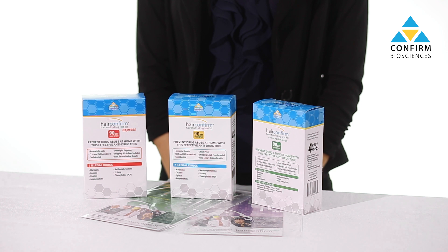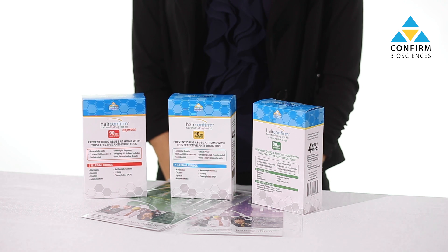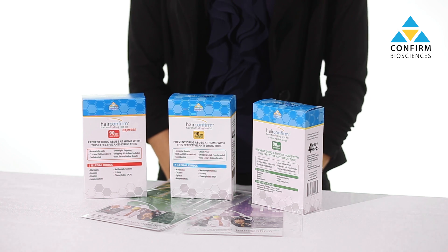Hi, my name is Sophia and in this video I'm going to show you how to use the Hair Confirm drug test. These tests provide a quantifiable drug history for up to 90 days and are available in different variations.